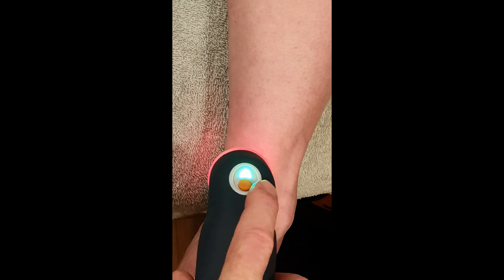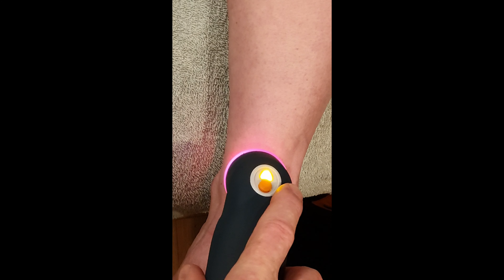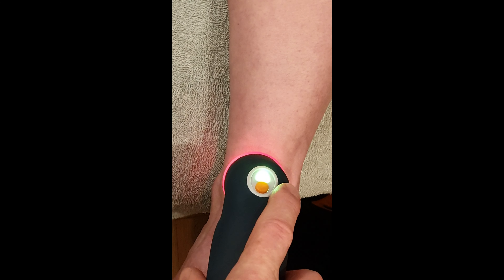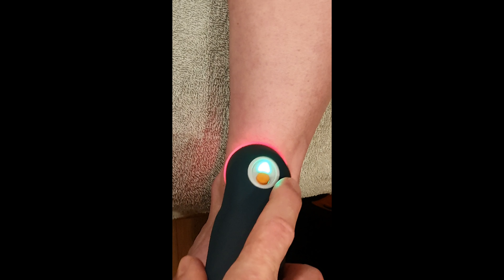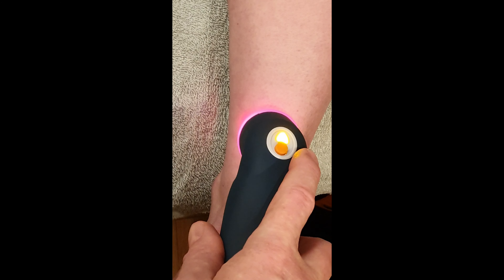So that's spot one. Moving down slightly for spot two — I'll fast forward here just so I'm not taking up too much time. That's spot two.